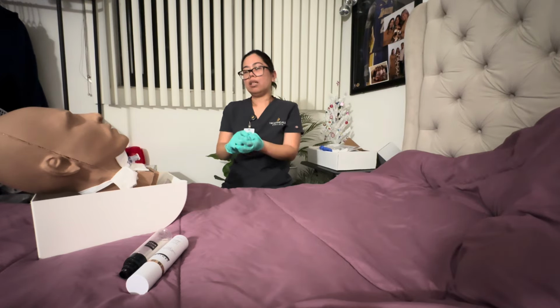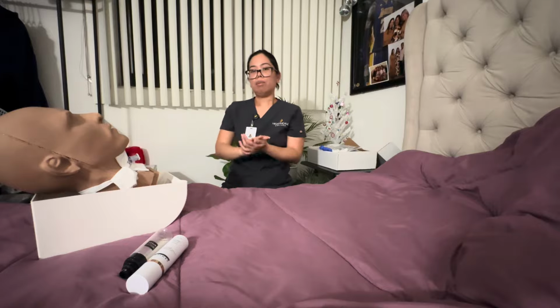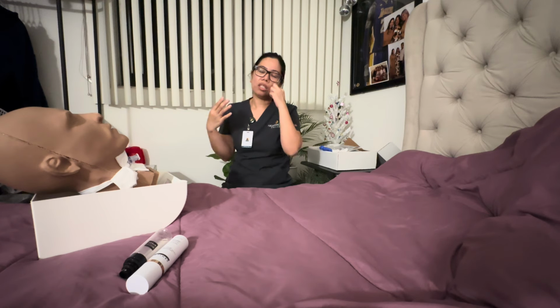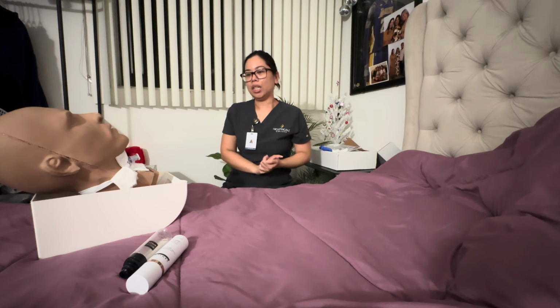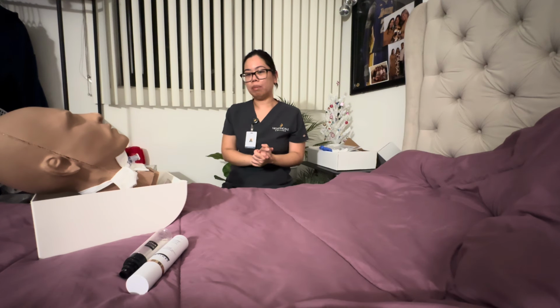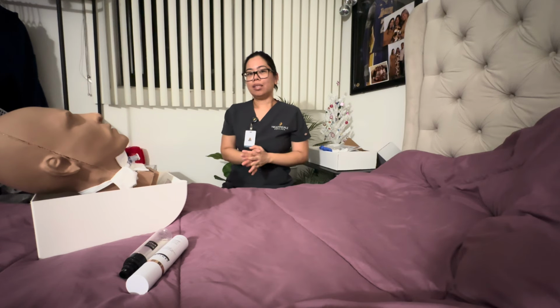And we're gonna go ahead and remove our gloves. We're gonna hand sanitize. Okay, and we're gonna keep asking questions to the patient, if they have anything they want to say, give them the comfort that they need. And the call light is within reach, make sure the patient's safe. And after hand sanitizing, we're gonna be documenting the process. And that's it for the tracheostomy care video. Thank you.